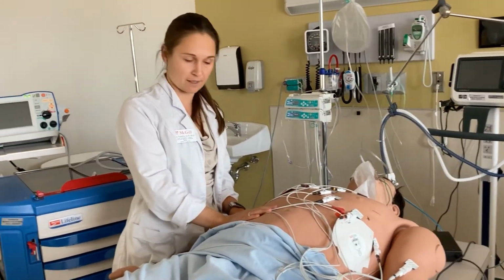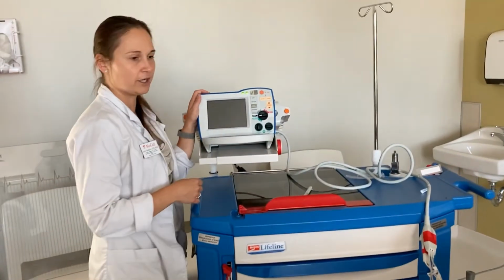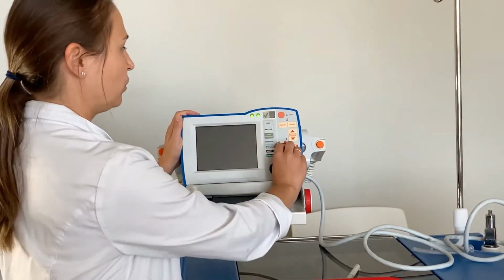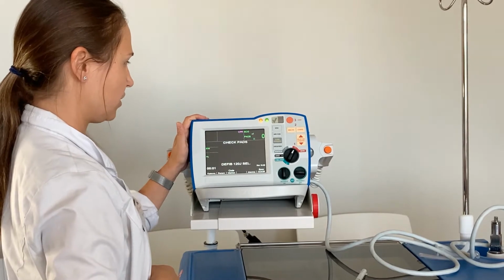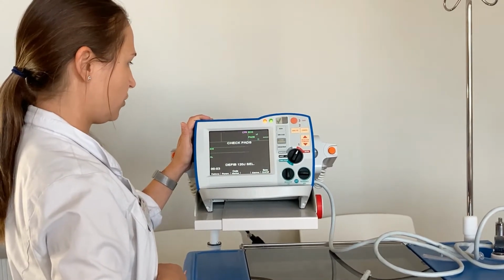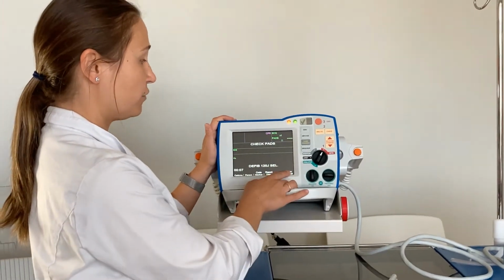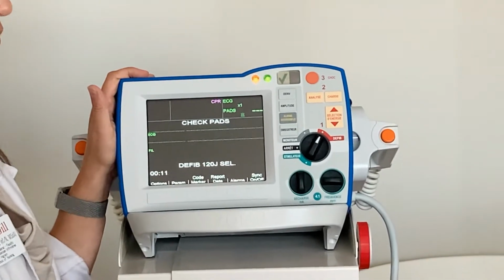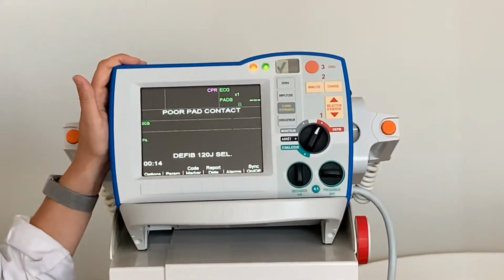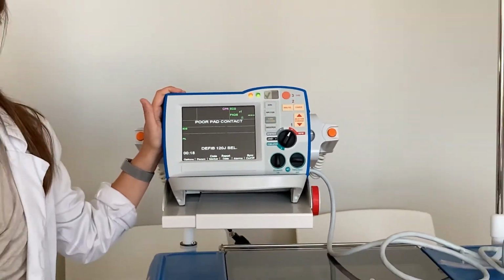What we're going to do next is we're going to turn on our defibrillator and we'll look at how cardioversion is done. At first, I will put it to defibrillation again and wait for it to turn on. Now, I'm going to have to turn on the sync mode, okay? So let's talk about the sync mode. Sync means synchronized, and the full name for cardioversion is actually synchronized cardioversion.